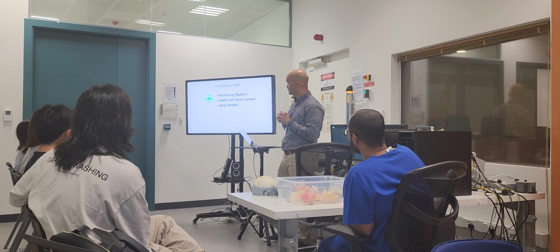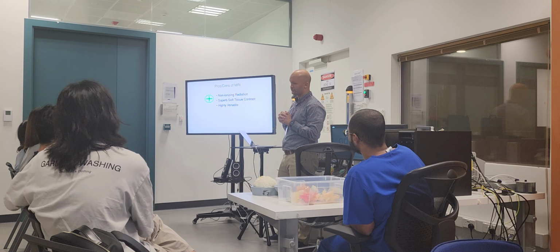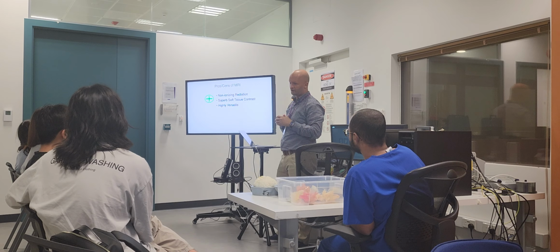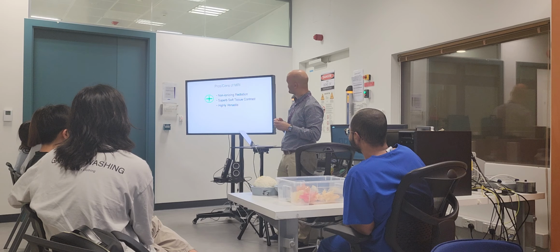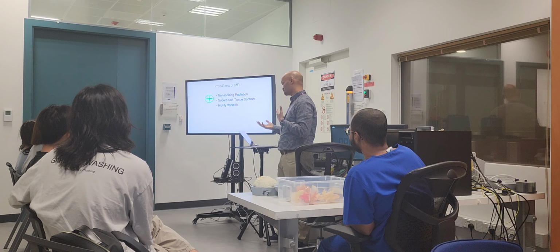MRI uses non-ionizing radiation and is highly versatile. I have a picture of my head, my heart, my knees, and my toes. It's barely a picture of my toes. It gives superb soft tissue contrast. It can image structure, function, and the connections between them.